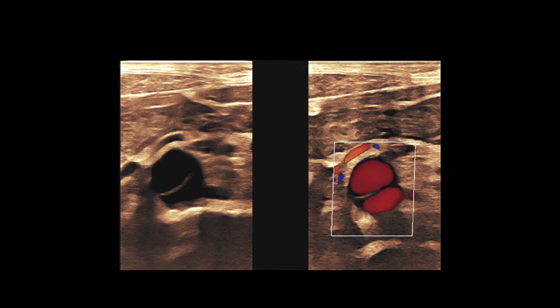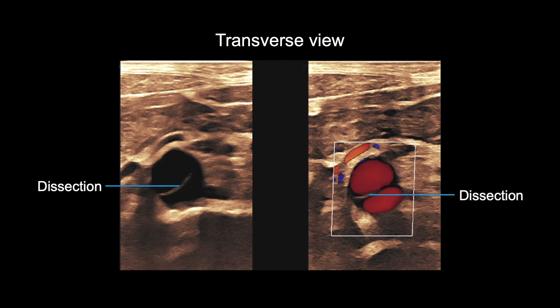Here is an example of what a dissection looks like on an ultrasound. You can see the same image in black and white on the left and in color on the right. The dissection is indicated by this bright line running through the lumen. This is best seen in transverse view.